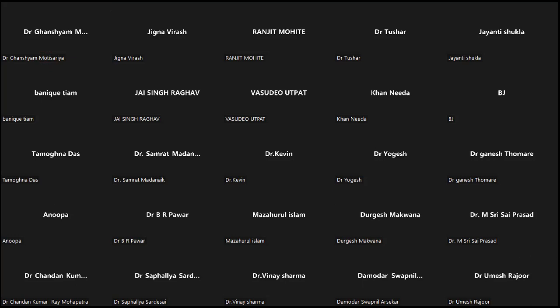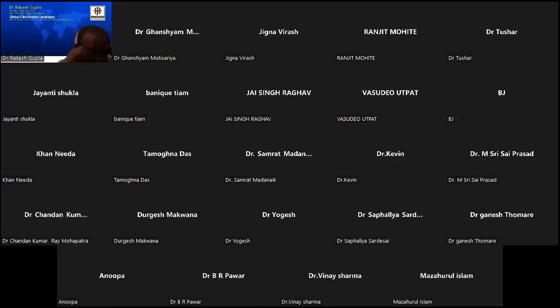Sir, Dr. Nida, there are two formulas to calculate regurgitant volume, sir, in MR. First is stroke volume of MV minus stroke volume of LVOT. And the direct method is LV stroke volume minus aortic stroke volume.